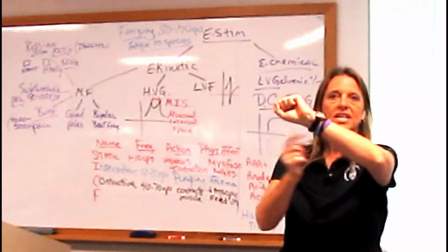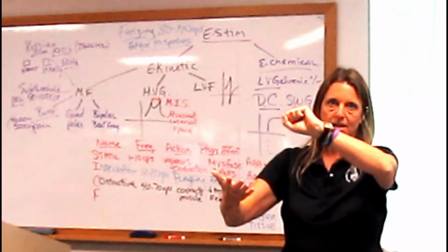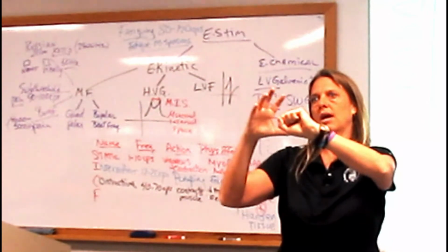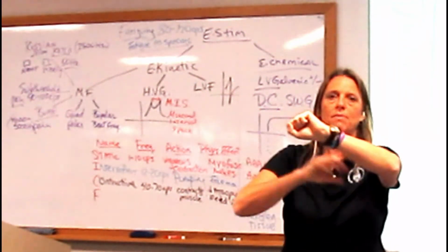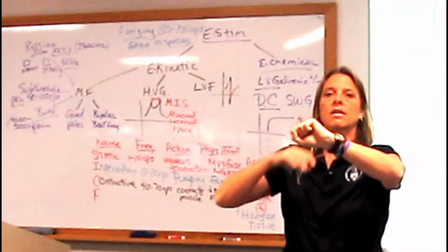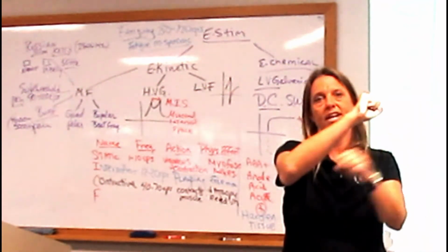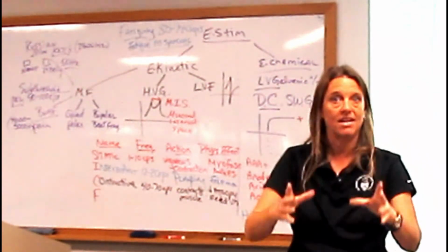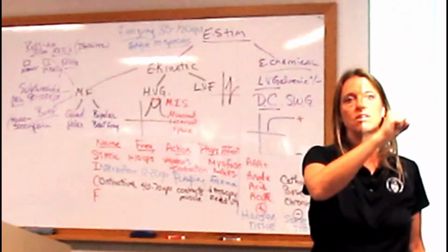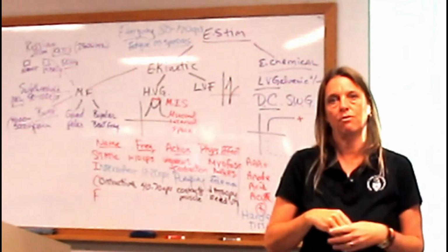So now the person can't tell you where the pain is, or the stimulus. They used to feel like under one pad and under another pad, but now it's going back and forth. This channel, on the other hand, is going at a different rate. So this is pumping back and forth in terms of intensity at one rate, and this one over here is in terms of intensity at another rate.